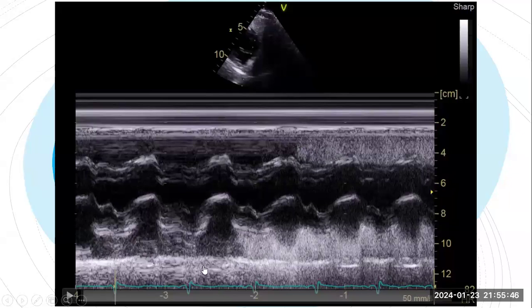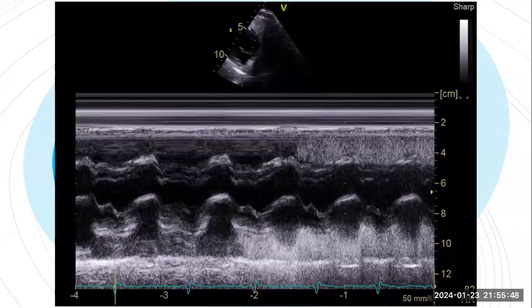This is just an extra example. How do we code it? That's not in the code sheet. I mean, this might just be part of the findings that you'll find. It's not in the code sheet. Okay.